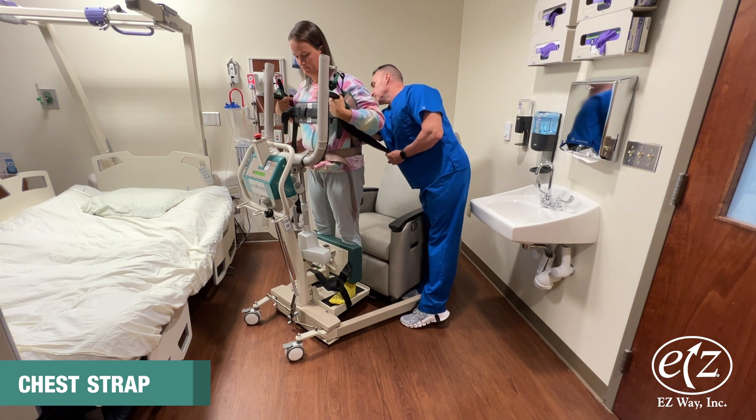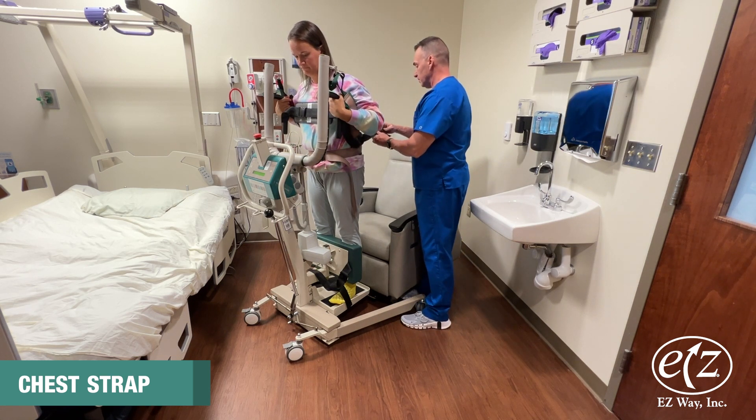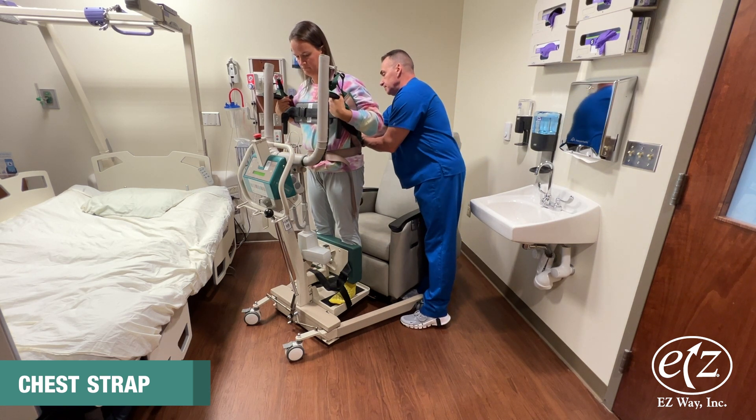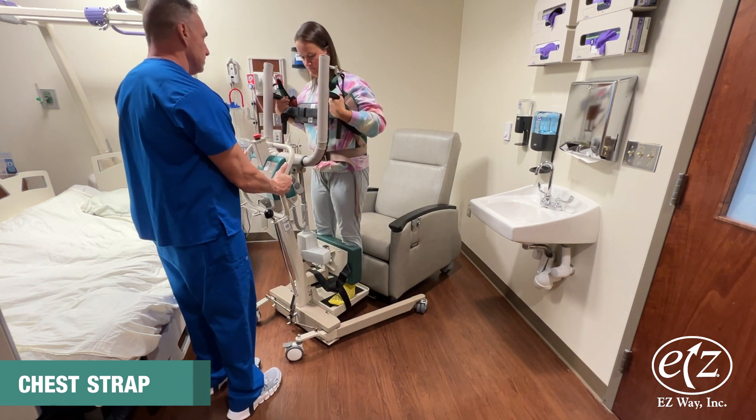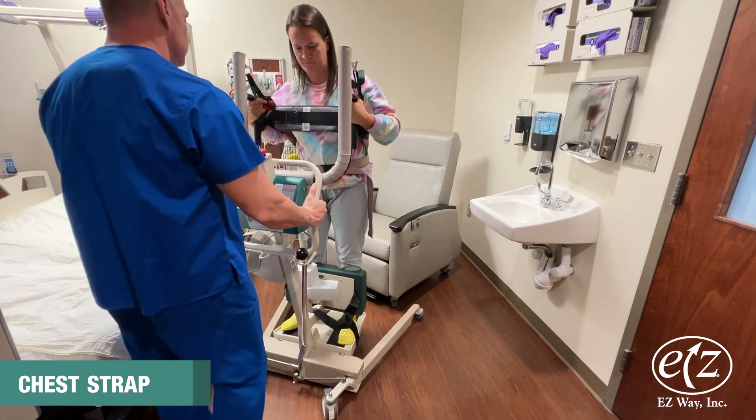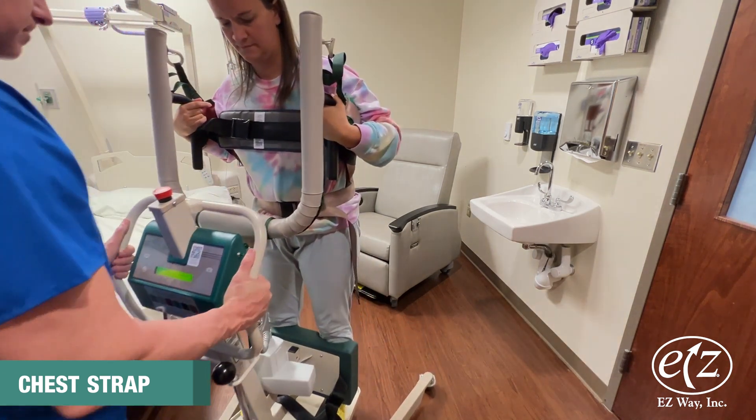Once a person is in a standing position using the harness, the caregiver may position and buckle the second set of straps behind the person over the harness. Use of these straps around a person is an optional procedure.